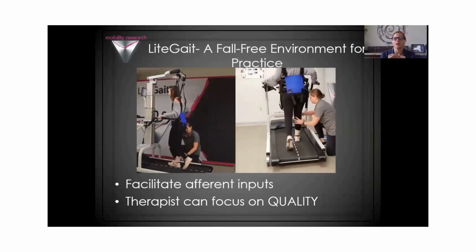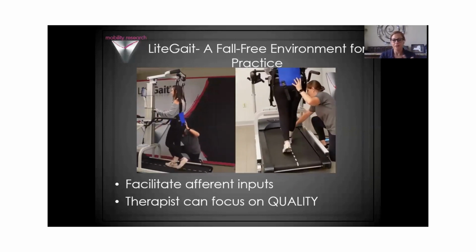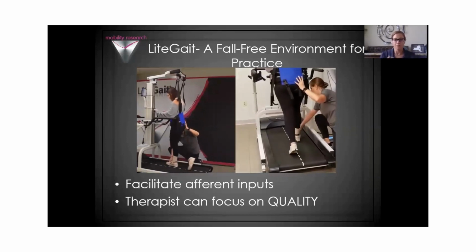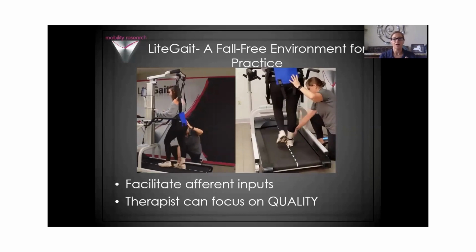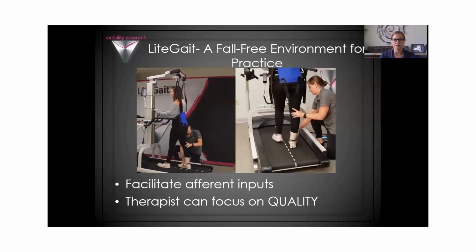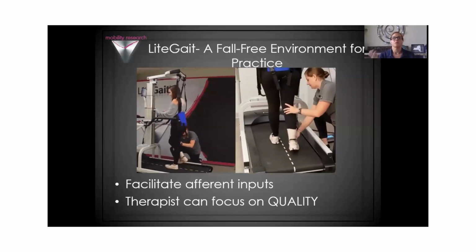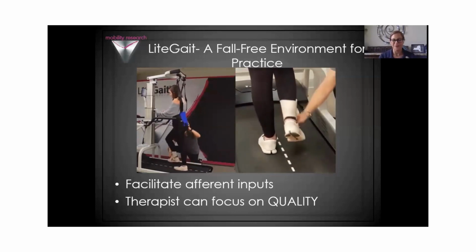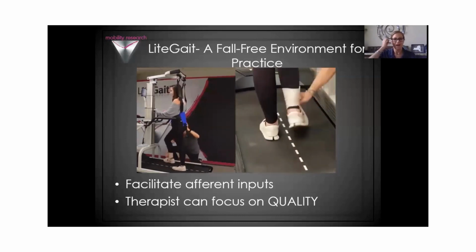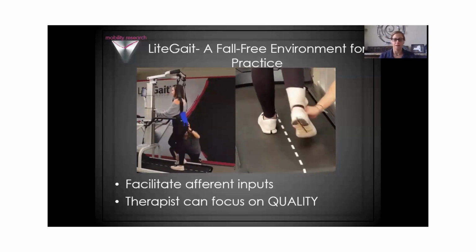Because it is a fall-free environment, it enables us as clinicians to be hands-free and really get in there and focus on the quality of the movement the patient is doing, and facilitate some good afferent input for what the patient needs to accomplish. It also allows us to support the patient and be more hands-off and let the patient problem solve their way through a movement pattern, as we saw in that first clip with the user walking on uneven surfaces.